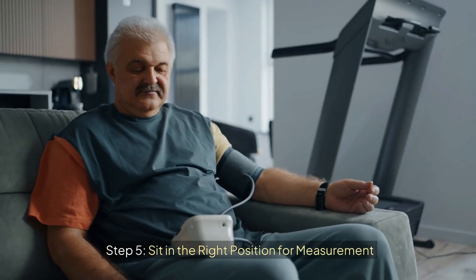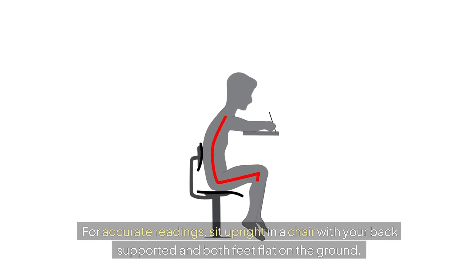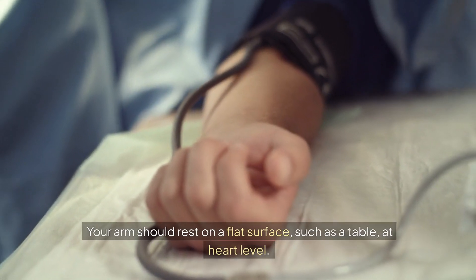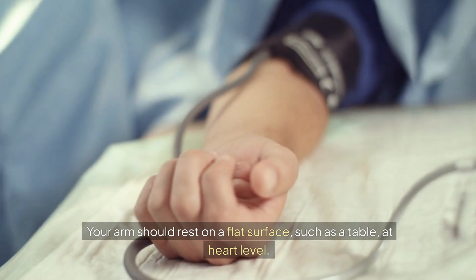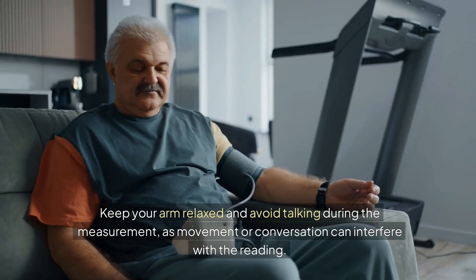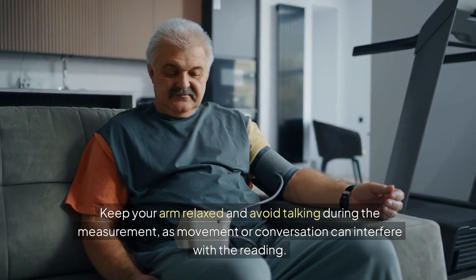Step 5: Sit in the right position for measurement. For accurate readings, sit upright in a chair with your back supported and both feet flat on the ground. Your arm should rest on a flat surface such as a table at heart level. Keep your arm relaxed and avoid talking during the measurement, as movement or conversation can interfere with the reading.